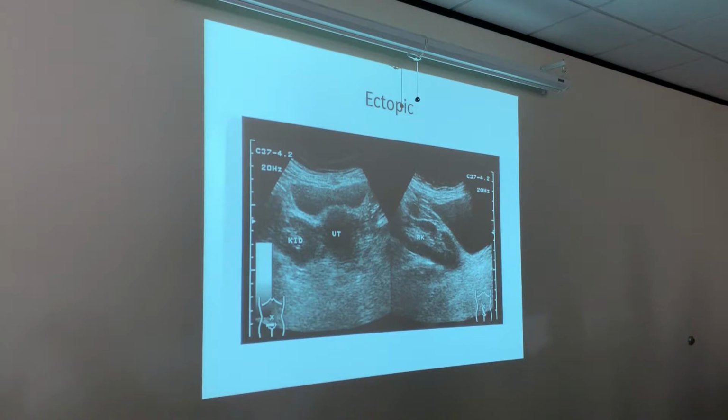You still have to document the renal fossas. A fossa is where something is supposed to be. Okay, the renal fossa. You document it in sagittal and transverse. And when you put fossa, that's telling the doctor, I don't see it. Or if the patient has a scar, you can say right kidney removed, left kidney removed. But you still document fossa.